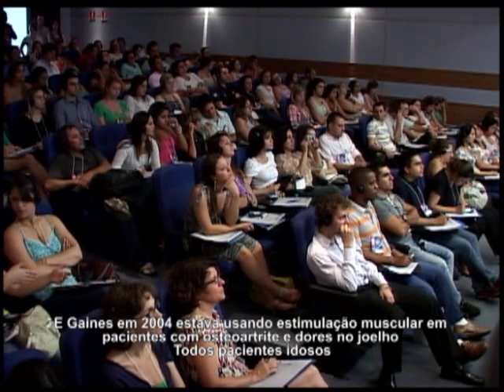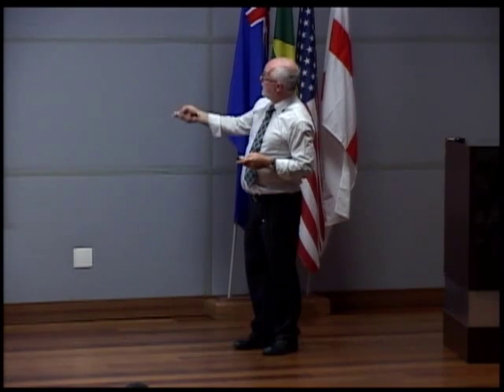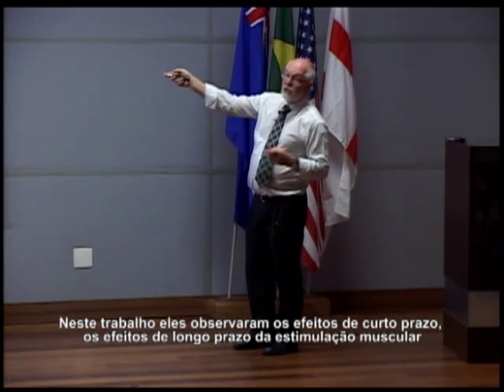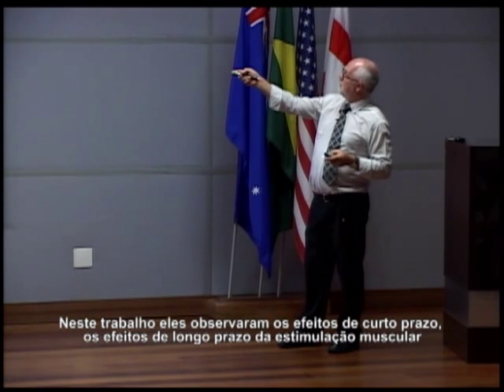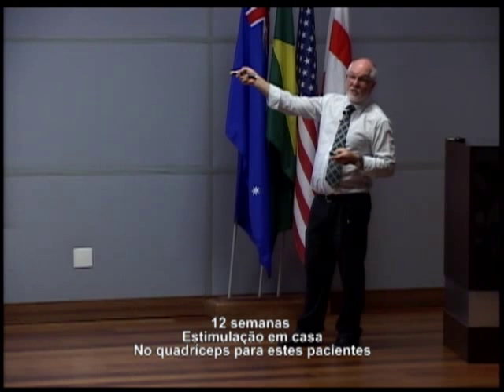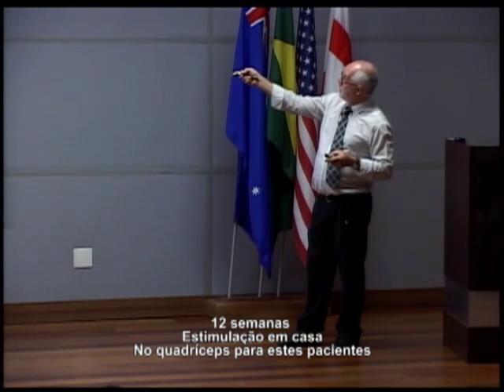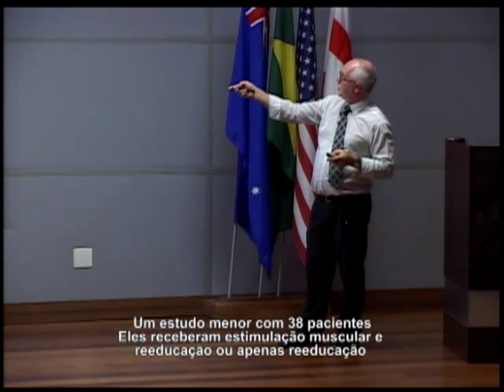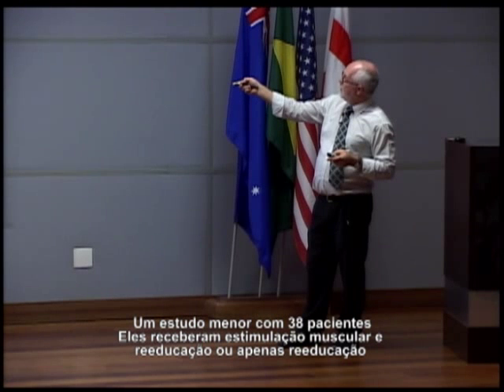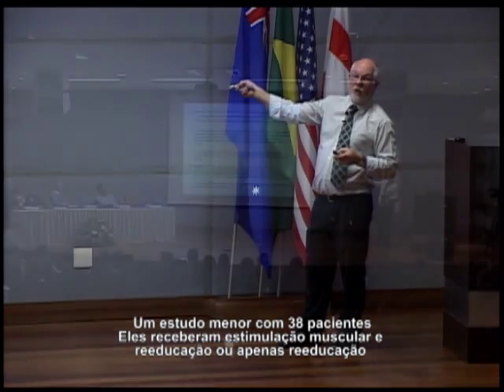This is not so new. This is 2004. And Gaines in 2004 is using muscle stim for patients with arthritis knee pain. These are all old patients, even older than I am. All right? These are really old patients. And they're looking at short-term effect and long-term effect of muscle stim, 12 weeks home stimulation over the quadriceps for these patients. Smaller study, 38 patients. They either had NMES muscle stim plus education or education only.